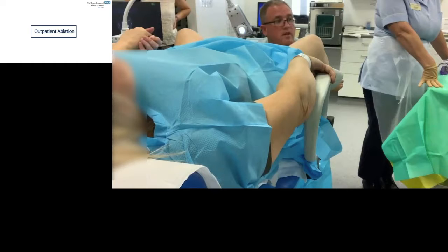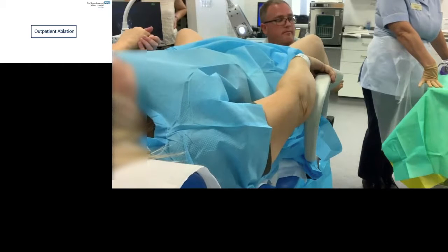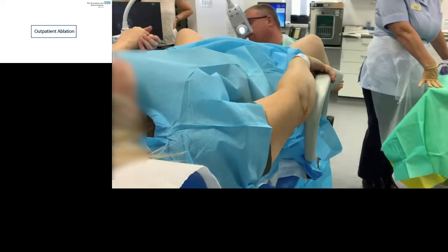So at the moment we're performing the cavity check, and this is distending the cavity to make sure there's no leaks or perforations prior to us proceeding. The patients are awake and they've all had diclofenac and Oromorph and ondansetron. Yeah, so it's passed. And you'll see there's a nurse to my left. You hear the gas leaking initially around the side of the cervix. He's testing up the scope. So I've just pinched the angle of the cervix on the right. Yep. And we've passed the cavity check now, and then we're off.